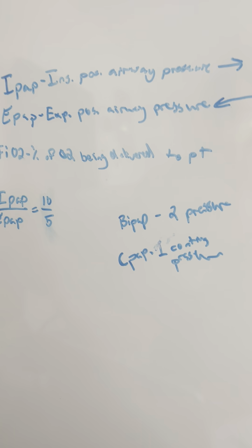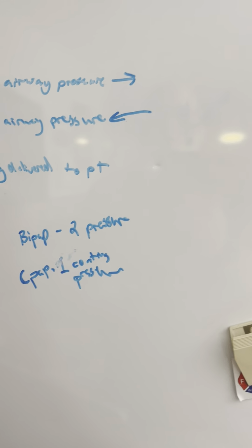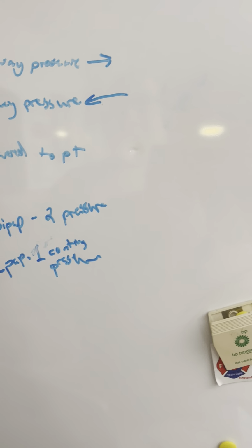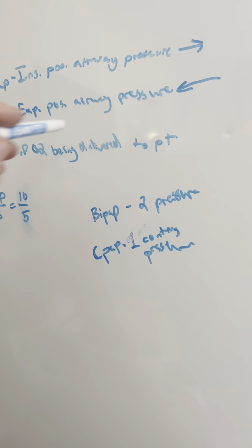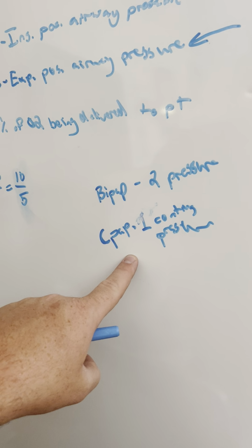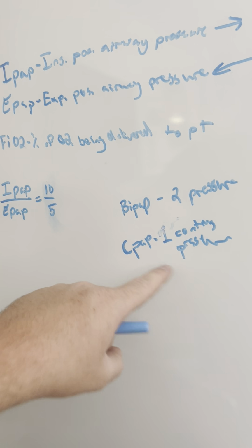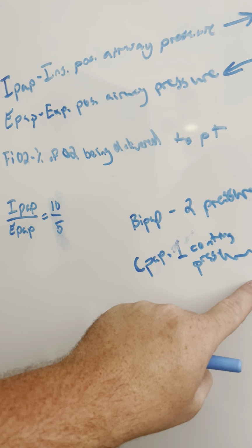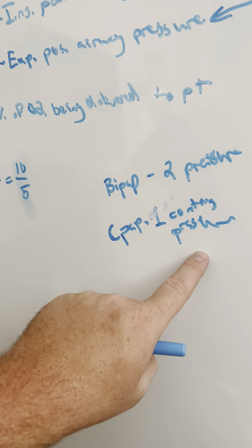And getting into why this is beneficial for our patients who are out of breath. They are breathing hard, they're tired. You see them tripoding, pursed lip breathing, the accessory muscle usage, their neck sucking in, they look exhausted. So think about it. With CPAP, if this patient's tired, we're helping them, but with one continuous pressure at all times, we are going to tire them out eventually.